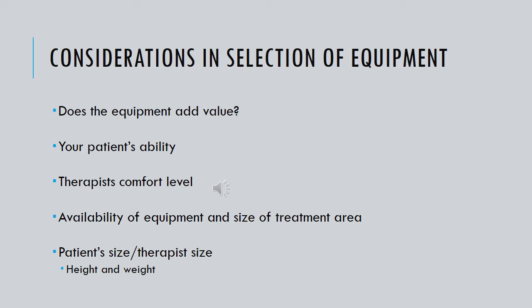Another factor of consideration would be your comfort level as the physical therapist in use of the therapeutic equipment and your confidence in being able to maintain your patient's safety when using the equipment. You will start to get some hands-on experience with this in the lab in terms of handling patients, safely getting them on and off equipment, and you'll be provided with instruction pertaining to that. But you need to develop skill and comfort in use of the equipment before you can think about then putting your patient on a piece of equipment or using a piece of equipment in any capacity.